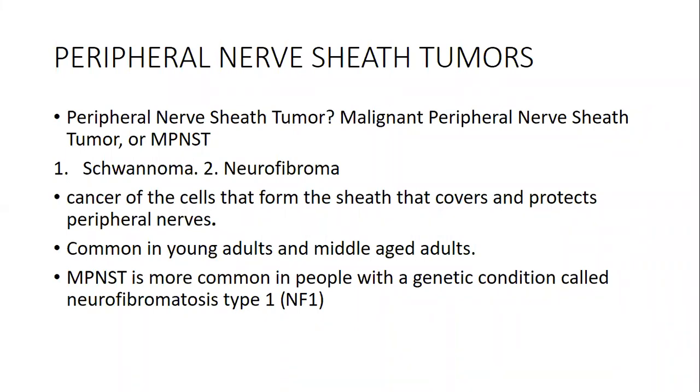When you go into the literature, they will still explain things like the most common people prone to this. It's a genetic component. You can have people within a specific age range and so on. But the key issue is once you are scanning the elbow joint, you must understand that there are specific tumors that may come into play, and they may present as solid or cystic with necrotic components within them.